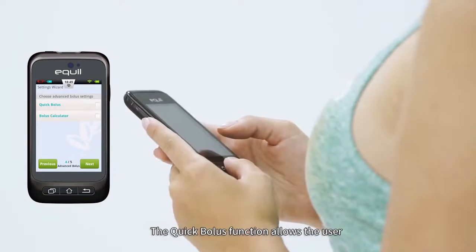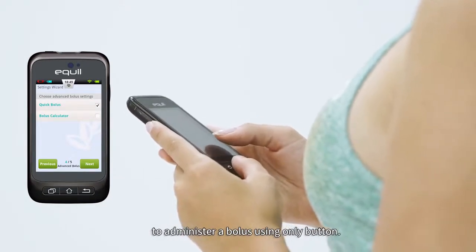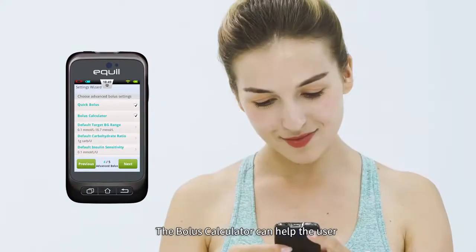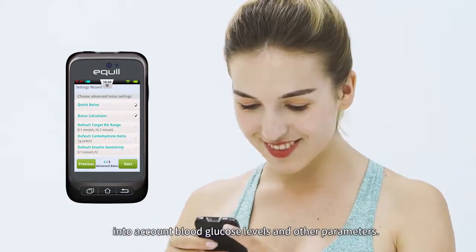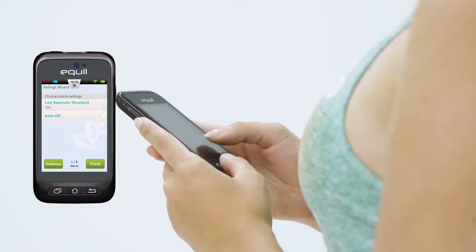The Quick Bolus function allows the user to administer a bolus using only a button. This feature is turned on with 1U by default. The bolus calculator can help the user decide on the size of a bolus by taking into account blood glucose levels and other parameters. Choose Next to enter the alert options.